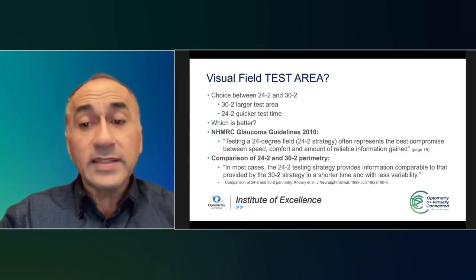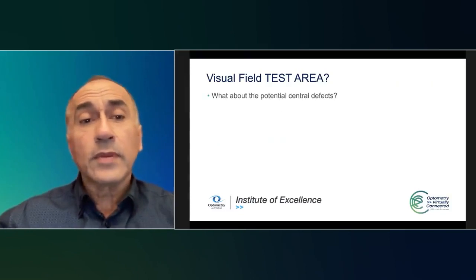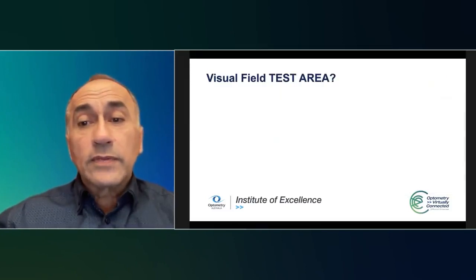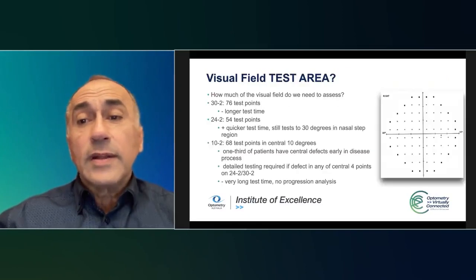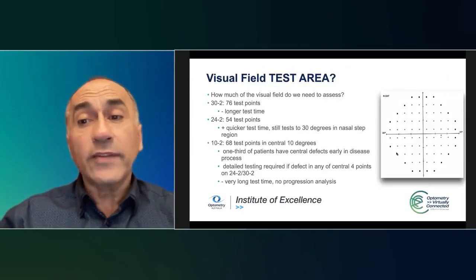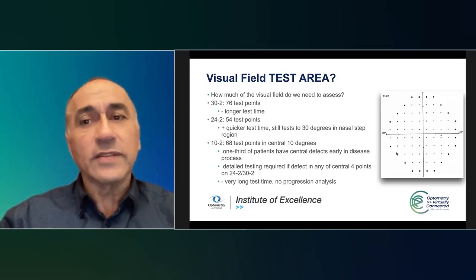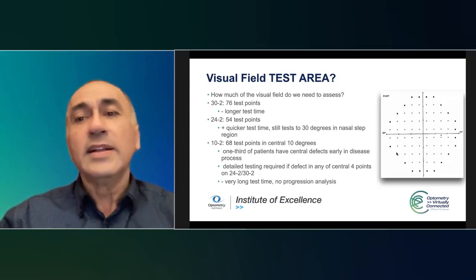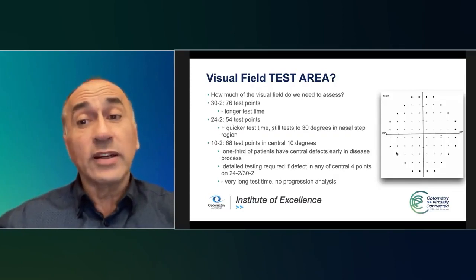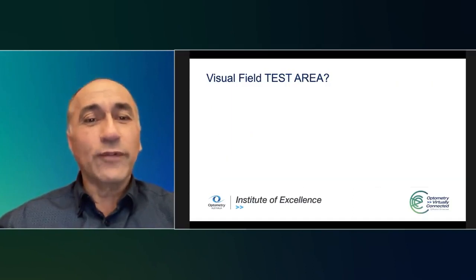What less variability means is that those outermost points, and I'll go back to them, sorry if I can find that image. Those outermost points there are harder to threshold accurately. They're quite variable because they're at the limits of the person's central field at the edges of the macular area. So the data you get from those is often highly variable and it's harder to detect change over time. They're what we used to call edge points in a visual field before we went to 24-2 testing.